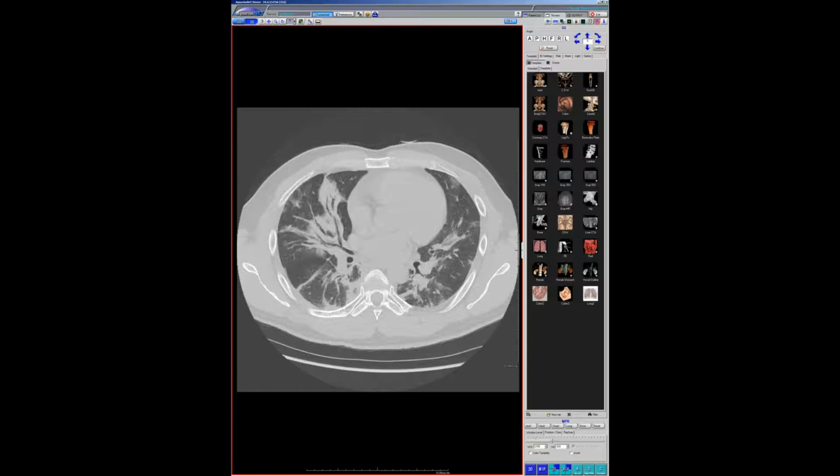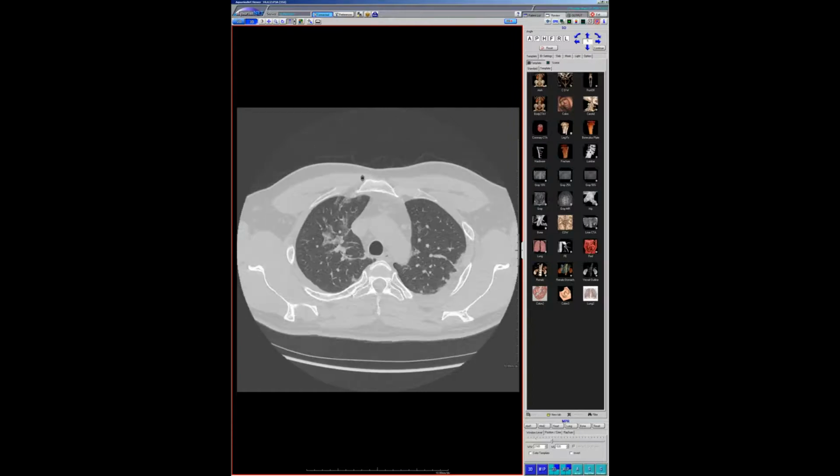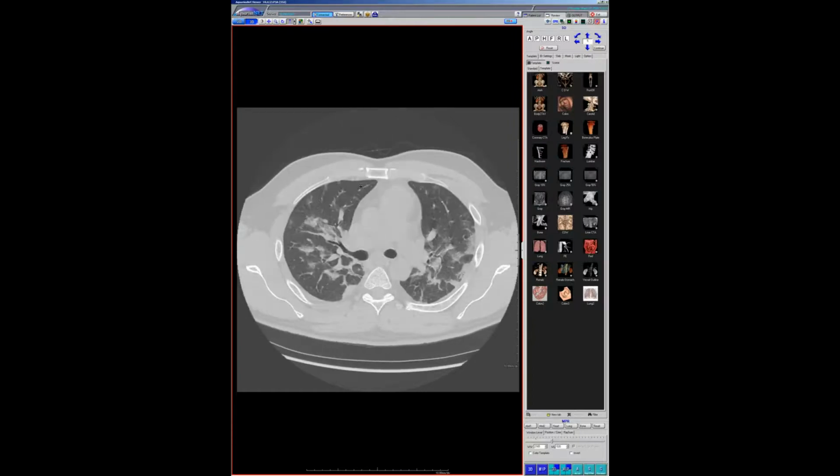Okay. I've seen one case that was shared with me of a patient that was pretty sick that had a really dense right upper lobe consolidation and pleural effusion, was COVID-19 positive, but was quite a ways out from when they originally got sick. I'm convinced it was a superinfection, but it had been on antibiotics already, so they couldn't culture anything. But it looked like nothing that had been reported. And had we seen it in any other context, we would have said it looked like a bacterial infection. So I've seen at least one presumed case, and I'm sure there were plenty in China that no one's reported yet.